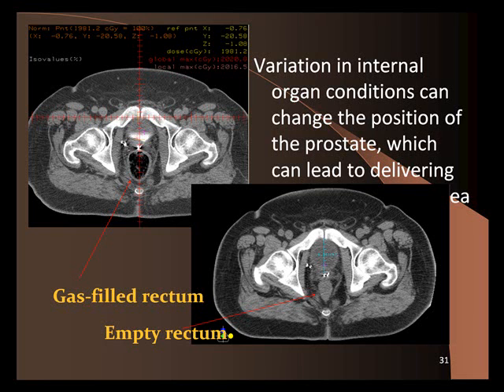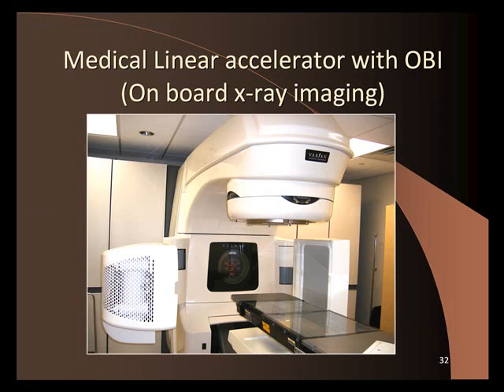Okay? So your dose is based on the linear accelerator. So this isodose bubble is set in the room. Okay? Because it's set based on the isocenter of the machine. But the guy's prostate can move. If he has gas, it can move. Okay, that's why we need IGRT. Because if we could have, I think there's another good slide here.